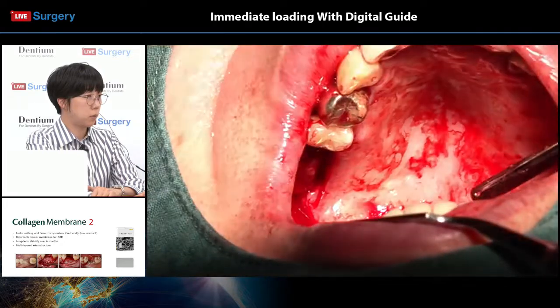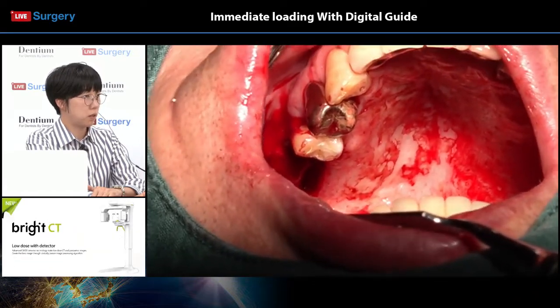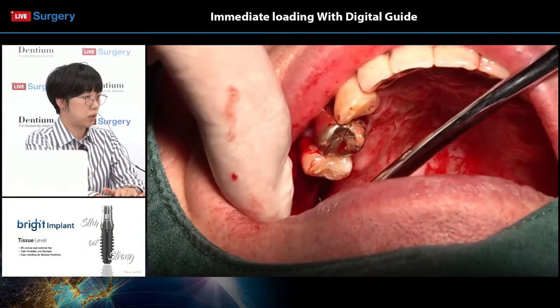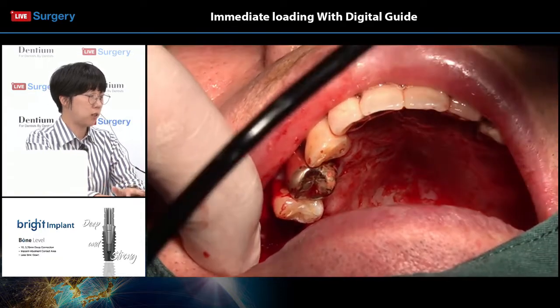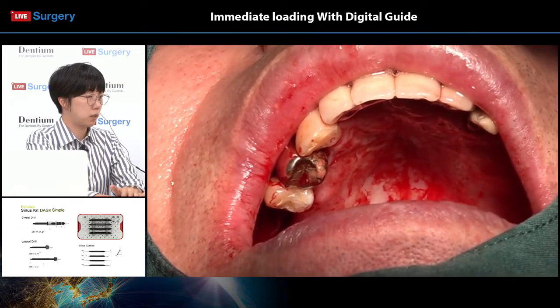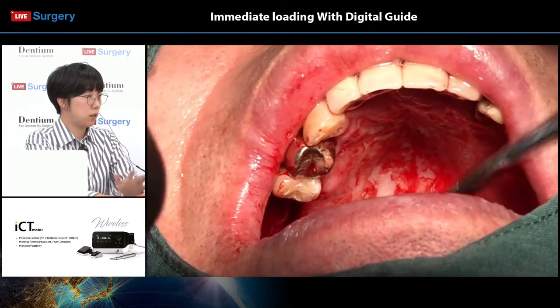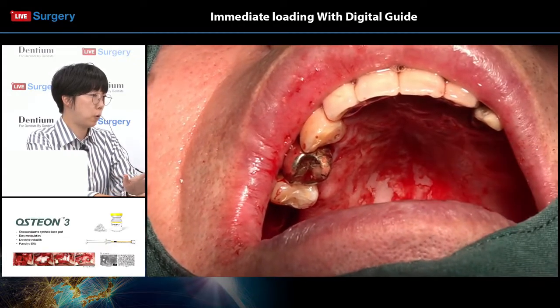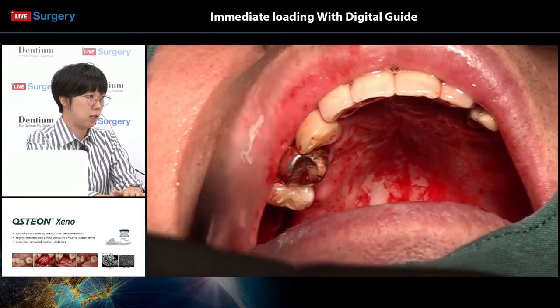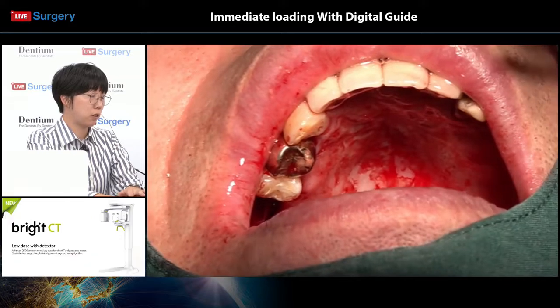I think Dr. Lee wants his implant on the number 16 area a little deeper than this position. At the same time, he probably would have checked his initial stability, and now he is checking the temporary abutment. Now he could have checked the temporary abutments and the bridges before putting in the membrane, but it doesn't matter as long as you're comfortable with the procedure. But like I've said, always membrane first before graft material.